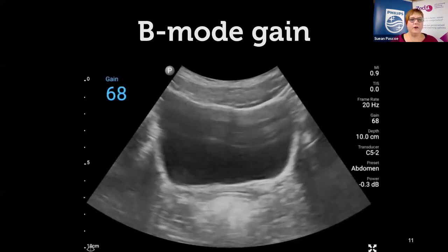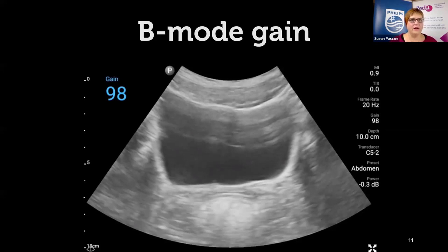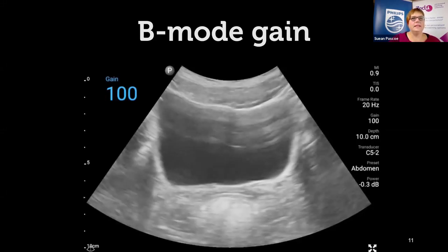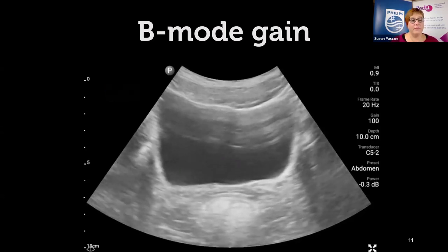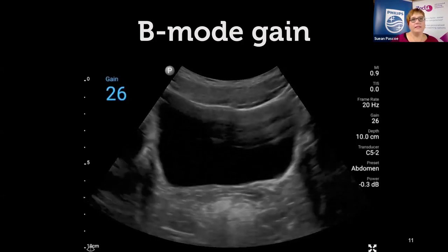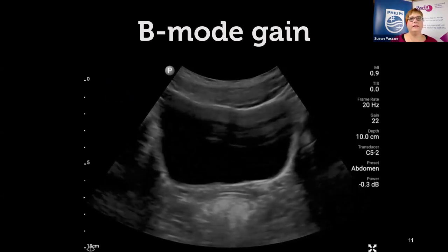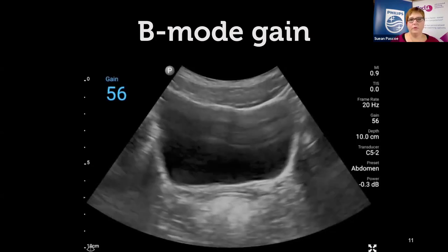You want to make sure the gain is set so it's black enough — you don't want to fill in echoes in the background. If it's too white, that represents artifactual echoes, which makes the B-mode look bad and also decreases your chances of getting a nice color picture. Make sure the fluid in the bladder is black. Wind down the gain on your cart systems; if you have TGC controls, turn down the near-field gain a little to get rid of near-field reverberation artifact.